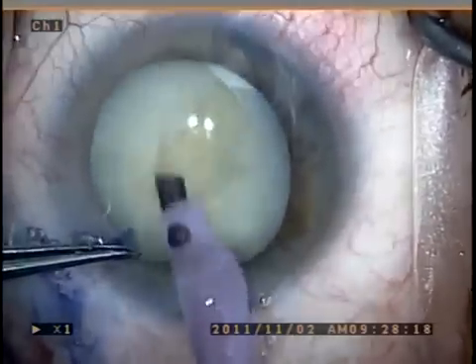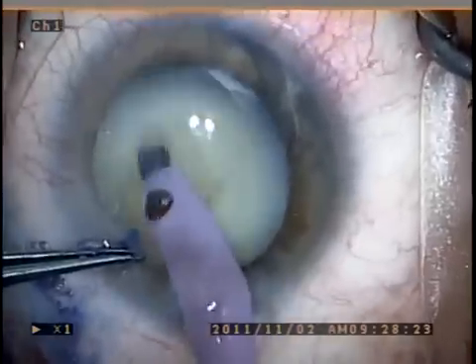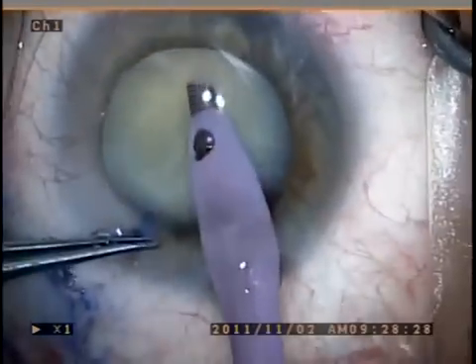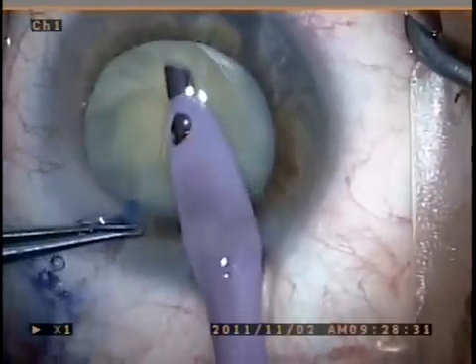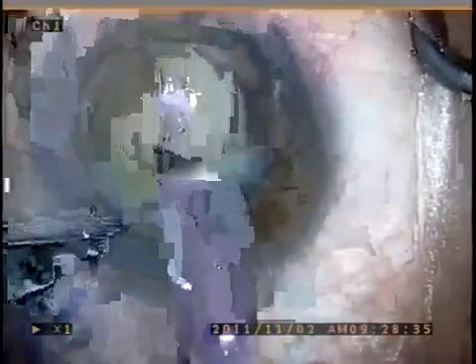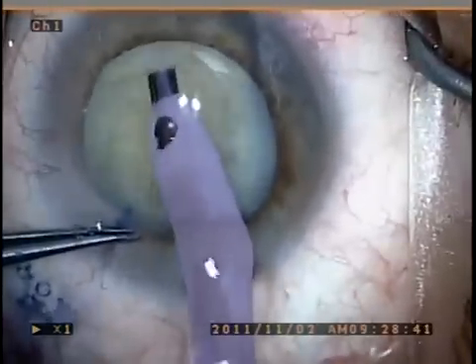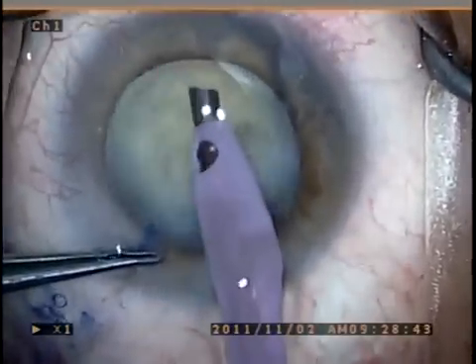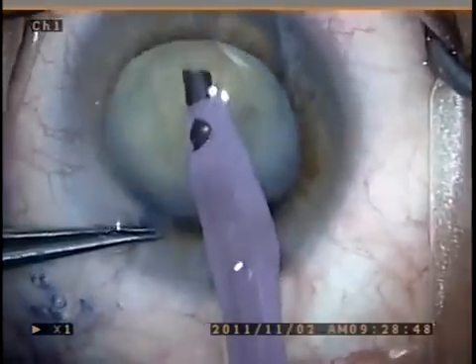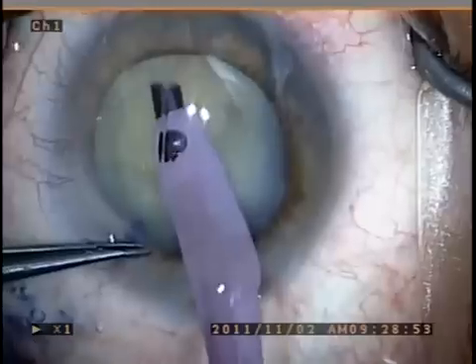I use a bowling technique where the central core of the lens is removed. You can see how mobile the lens is since it's lost its cortical moorings by virtue of the fact that all the cortex has been liquefied. There's no more support structure for the lens within the bag.